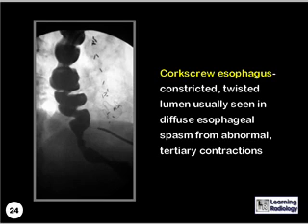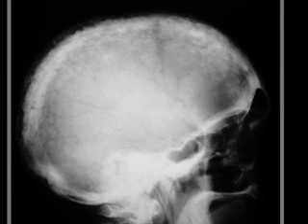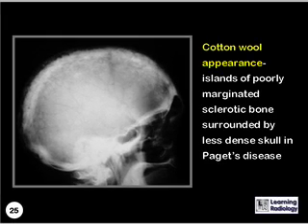What is the name of this pattern? This is the cotton wool appearance, islands of poorly marginated sclerotic bone surrounded by less-dense skull in Paget's disease.